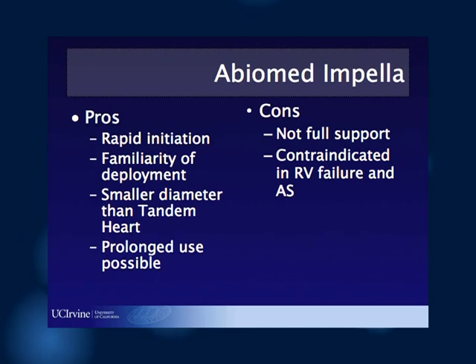The disadvantages of the Impella also indicated that it was not complete support, as would be identified for the Tandem or CPS support devices, and it was also contraindicated in right ventricular failure and aortic stenosis.